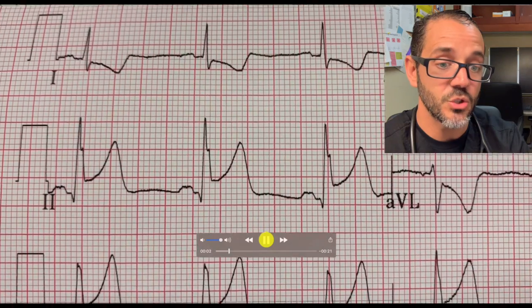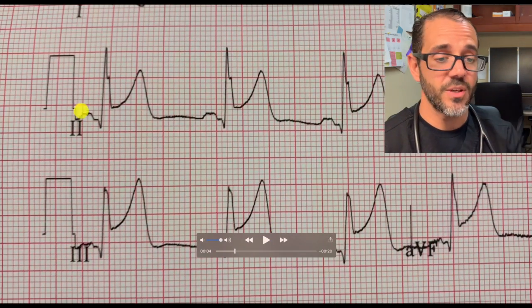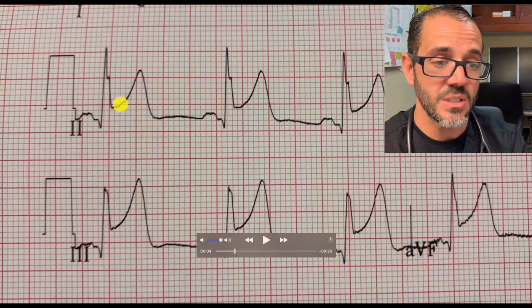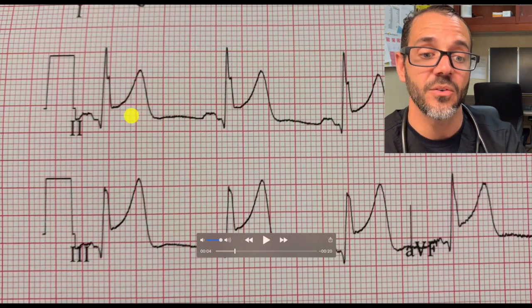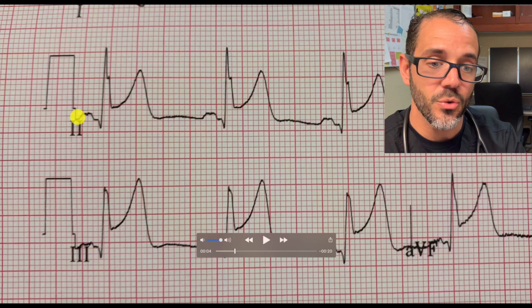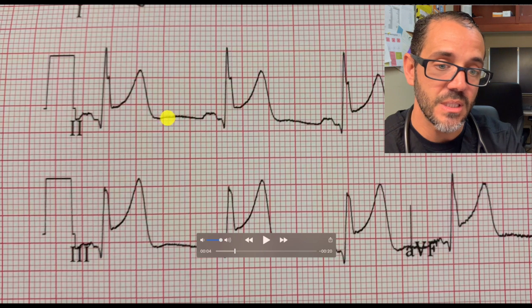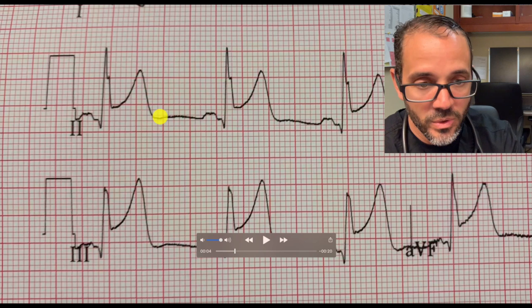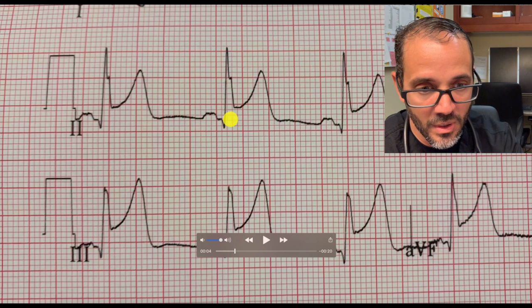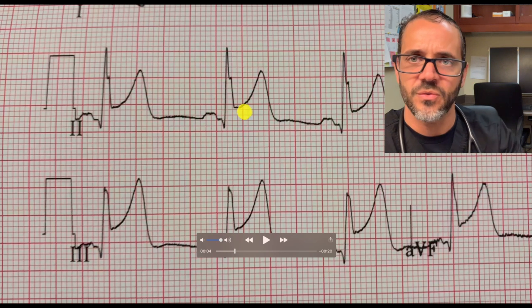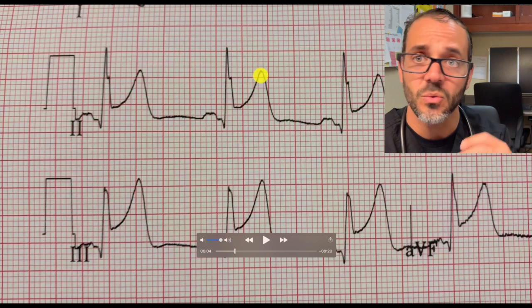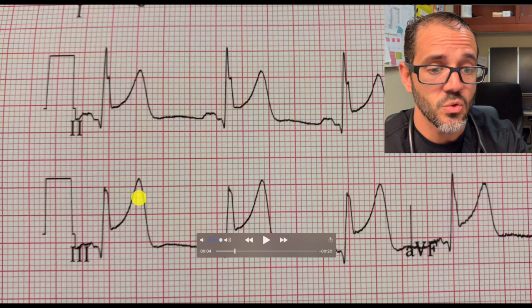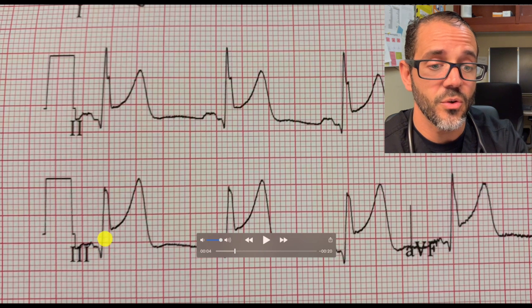You can see lead two. Lead two is very impressive — you can see a gross ST segment elevation. If you throw the line through the TP segment, you can see that this ST is at least two boxes above where it starts concaving and going up. That T wave is very pronounced — a hyper-acute T wave as well.